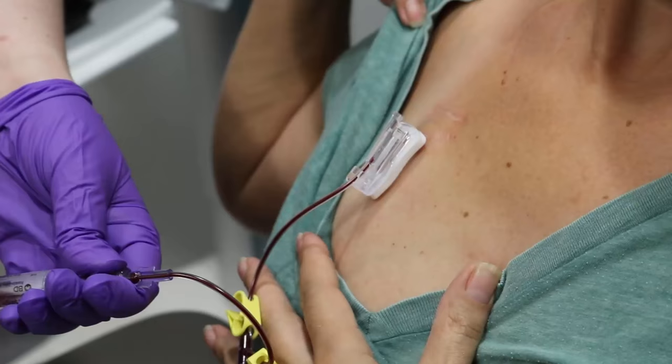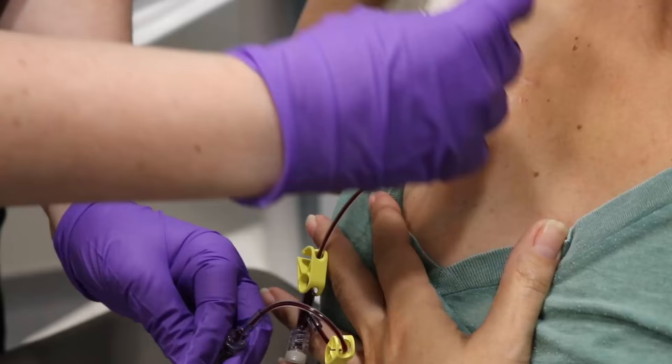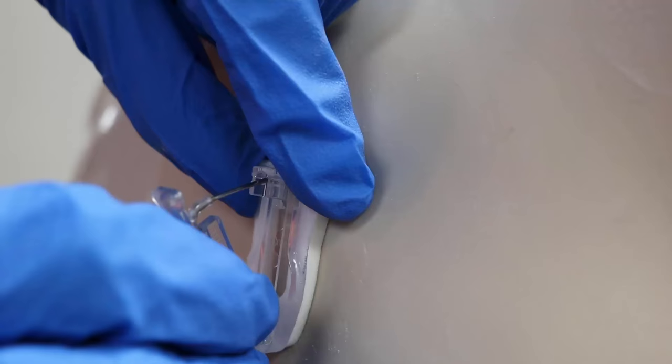If you need blood drawn, it will be done through your port at this time. If you are having a procedure or treatment today, the port needle will be left in and a dressing applied. Once your treatment is complete, your port will be flushed with normal saline and the needle removed. A small band-aid will be applied, which should be removed in a few hours.